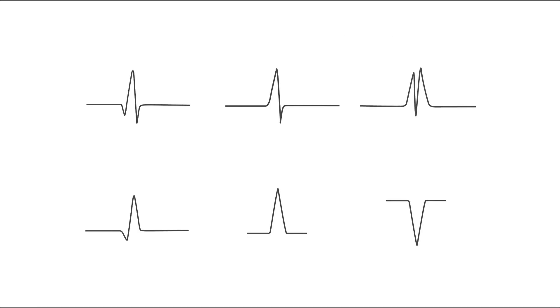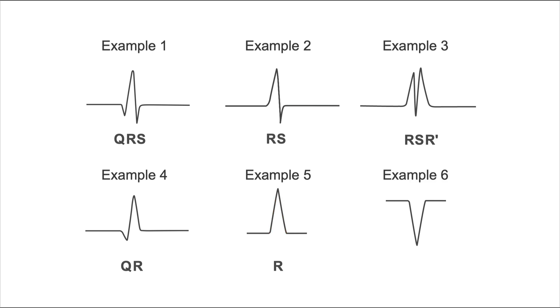Here are the different examples again. Take a closer look at them. In example number one, we had a Q-wave, an R-wave, and an S-wave. In example number two, we had an R-wave and an S-wave. In example number three, we had RSR-prime. Example four shows a Q-wave and an R-wave. Example number five shows just one big upward deflection, which has to be an R-wave. Example number six shows just one big downward deflection, which has to be a QS-pattern.